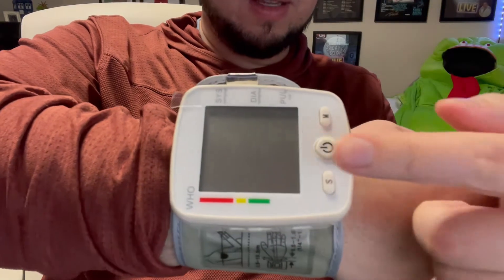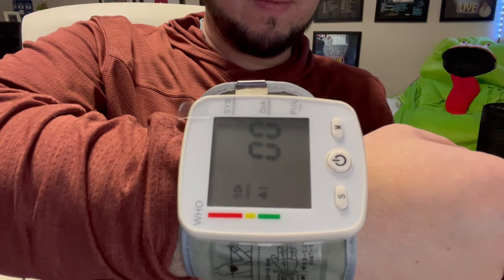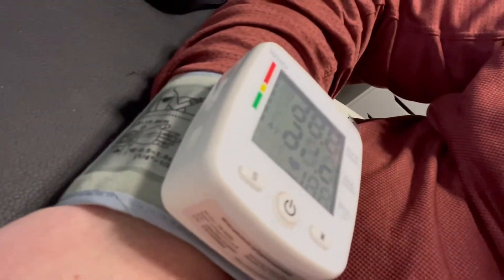It did something. The device says: 'Please remain seated and refrain from talking during measurement, and keep cuff at heart level.' It's tightening up on me.